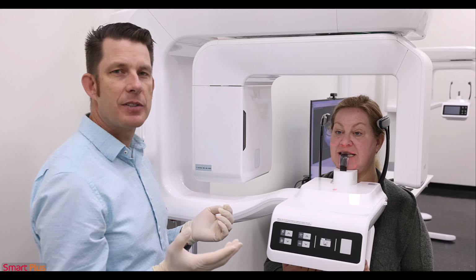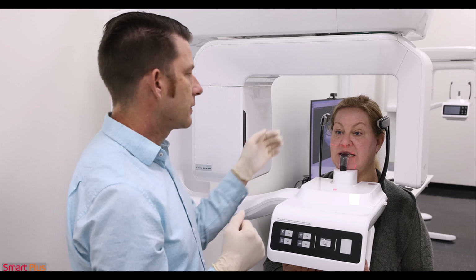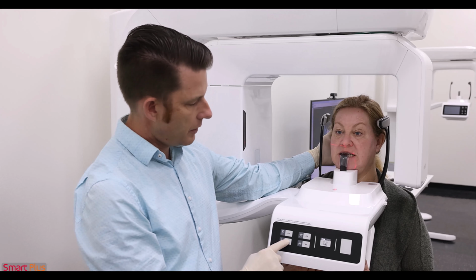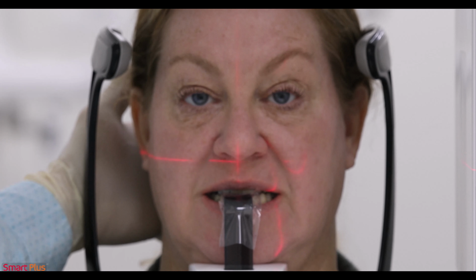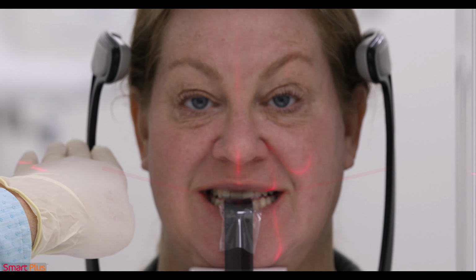What often happens is whenever you position your patient and you start to lower the chin rest, they start to hunch down. So I'm going to gently push on the back of her head here. And I'm also going to lower this down. And as I do that, go ahead and smile really big for me. I can see that her occlusion is tipped down at about a 10-degree angle.